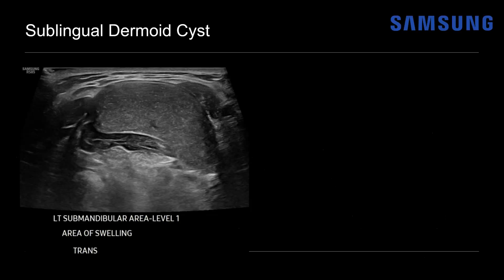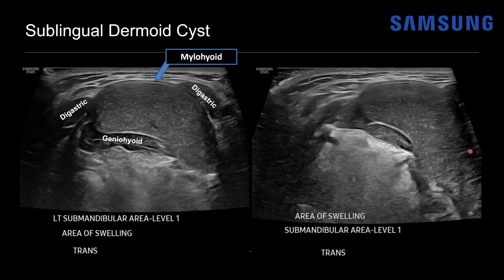On ultrasound of that same area in a transverse image, we can see the mylohyoid muscle as a thin hypoechoic muscle bounding this mass, which looks more heterogeneous than the previous dermoid cyst and has punctate echogenic foci throughout. The anterior belly of the digastric muscles seen on CT are visible here, as well as the geniohyoid muscle. Adjusting the transducer, we can see the mass is eccentric and deviated to the left. The geniohyoid and mylohyoid confirm we're in the sublingual space. The mylohyoid continues toward the adjacent hyoglossus muscle, whose anterior aspect protrudes into the posterior sublingual space — another important anatomic landmark.